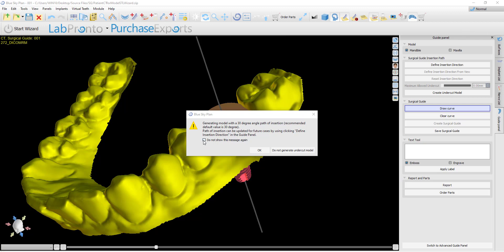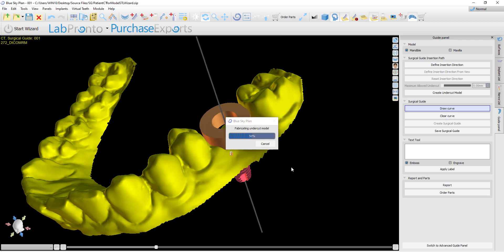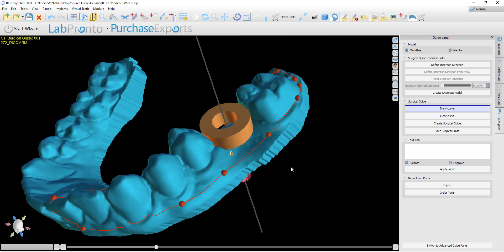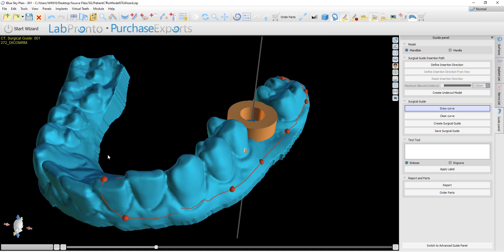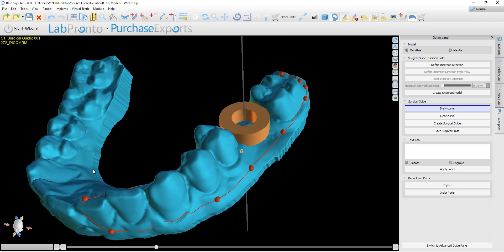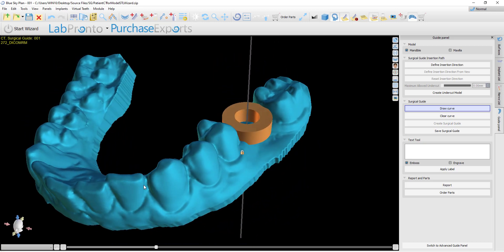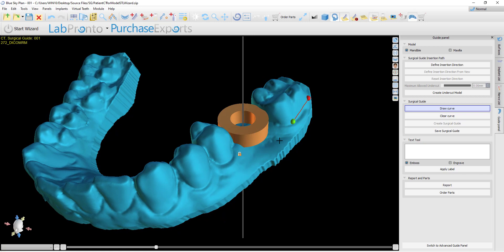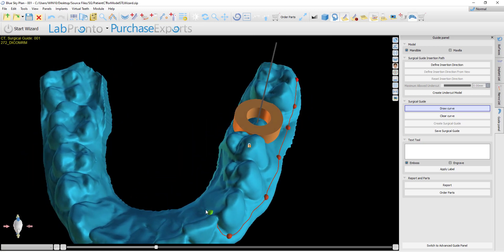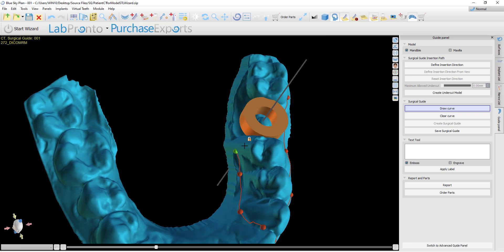If you don't want to see this message again, simply click 'Do not show this message again' and then click OK. Once OK is clicked, the software automatically generates the model with undercuts removed. What's important to keep in mind here is that this is the model on which the curve should be drawn and on which the surgical guide should be generated. Users should not switch to a different model, but rather should use the model that was automatically generated by the software to proceed and draw the surgical guide curve and fabricate the surgical guide. Here, once again, we can see how the undercuts were removed when generating this model.